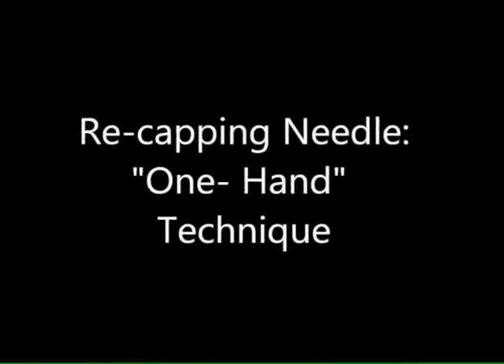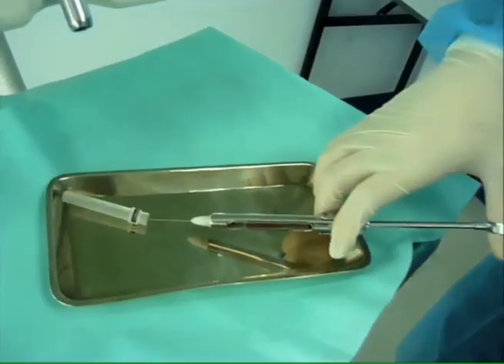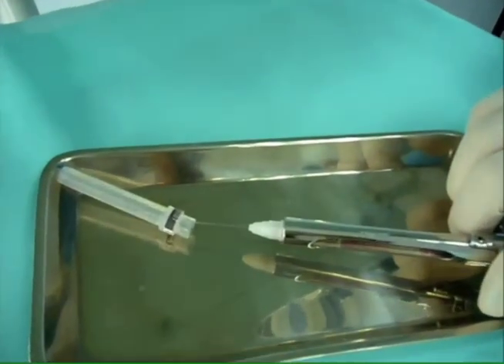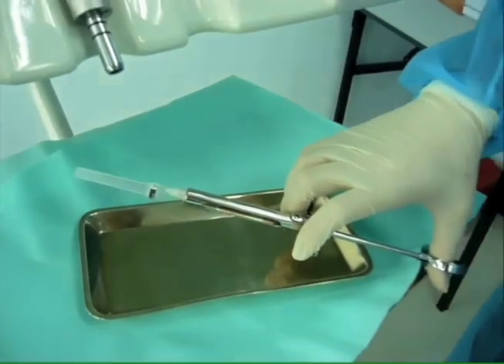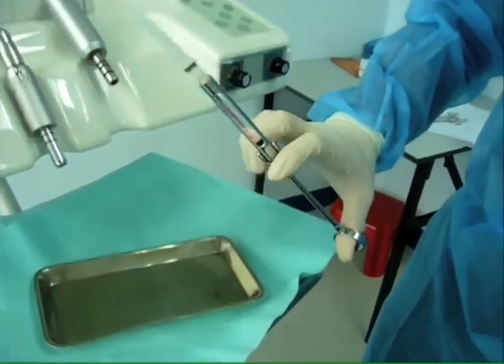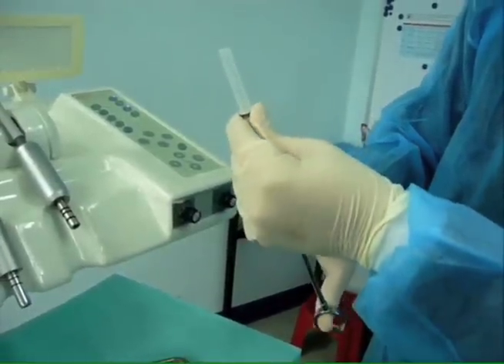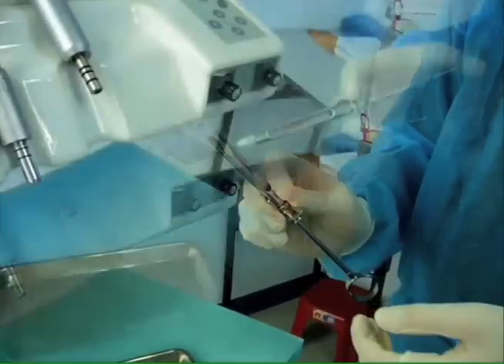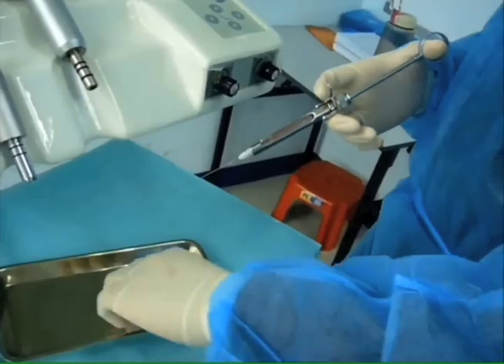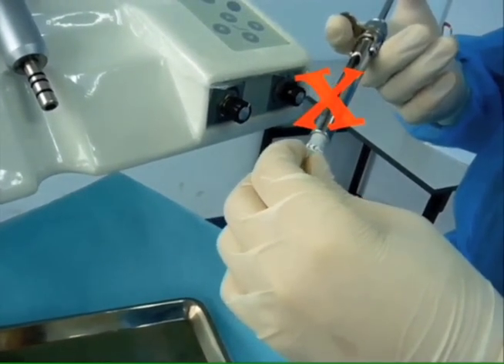Recapping needle — one hand technique. After using the syringe, it should be recapped immediately. The uncapped needle is slid into the needle sheath which lies on the instrument tray or table. Ensure that the needle is fully covered by lifting the sheath from the tray and finally secure it by holding the sheath near the syringe adapter and locking it in place. Do not hold the needle sheath in one hand and attempt to secure the needle as it may lead to needle stick injuries.